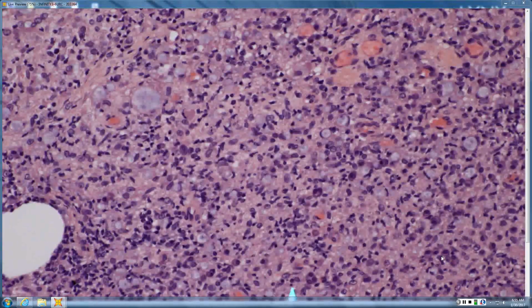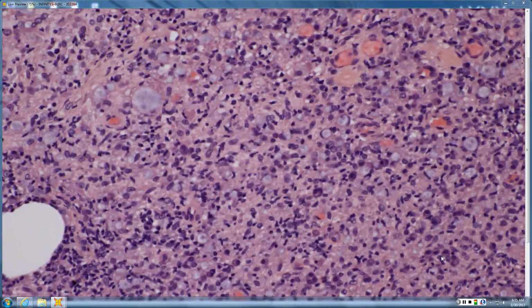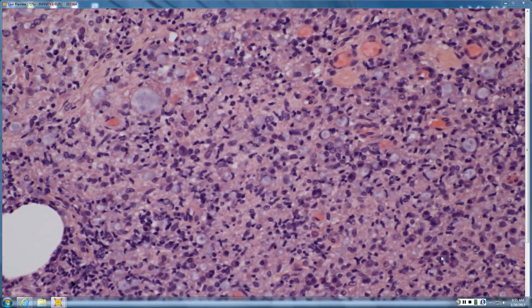And this is just chock full of a mixed infiltrate. So there's lymphocytes, there's lots of histiocytes, there's also plasma cells. You can see here, maybe you'd find the occasional eosinophil or something. But so that is lepromatous leprosy, and then the next slide. Those are globi, Justin? Yes, those are the globi. Those large vacuole collections of organisms.